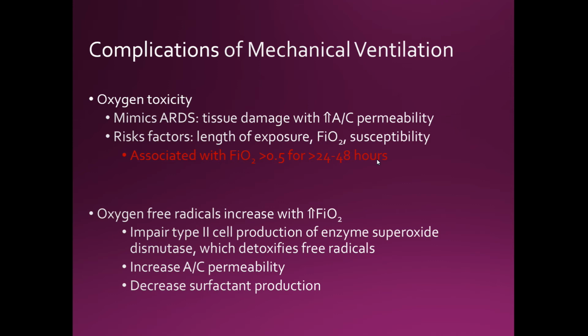So it's almost like a Venturi, and it's working on the Venturi principle. What they do is close off the air part and give 100% oxygen. What does that do? Oxygen is a dry gas, so it is going to dry the patient out. They're not going to cough as much. They're not going to trigger the high pressure alarm. And everyone's going to have a quiet night.